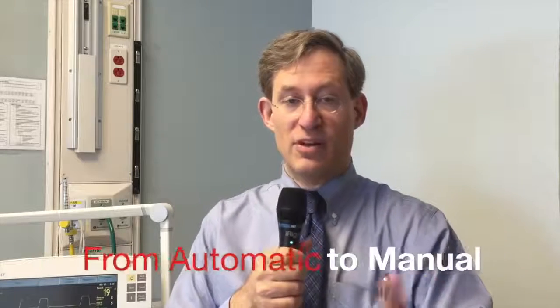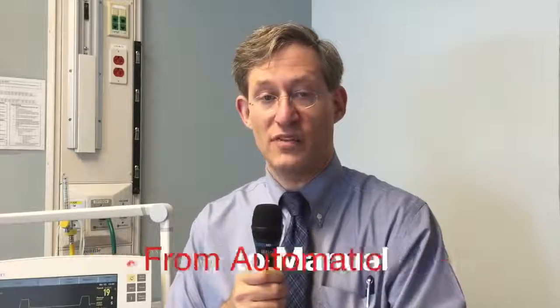There are some times where you will see the intensivist and the respiratory therapist work with each other and disengage the patient off of PRVC and formally switch them to either a volume control mode or a pressure targeted mode like pressure control. And it really is like taking a car and switching them from an automatic transmission to more of a stick shift, where we want to specifically either dial in a pressure or dial in a volume and have a volume delivered, rather than have the ventilator dial up and down on a pressure to try and get that tidal volume that we dialed in.